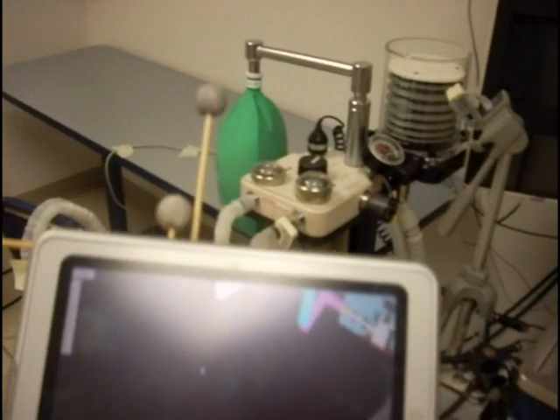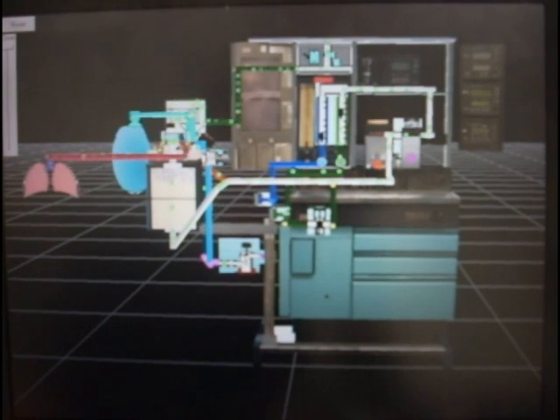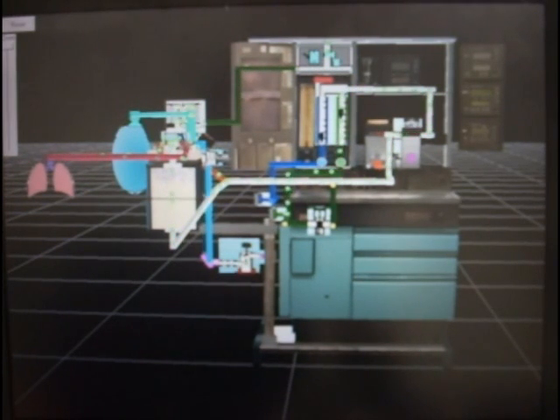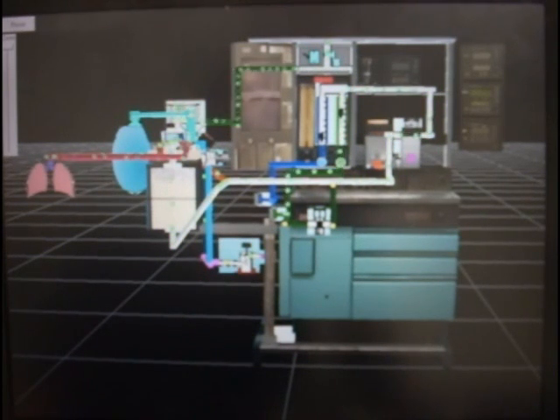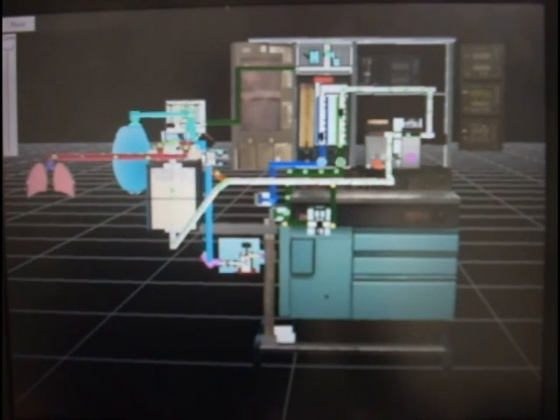The AM takes the abstract animated icons and gas flow visualization from the VAM and superimposes them over the real machine. Here are some examples of the interaction and visualization in the AM.